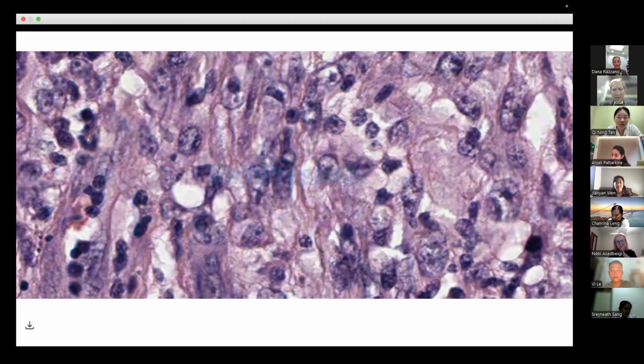We'll get into more melanocytic stuff in our next mentoring session. Today was more on the squamous lesions. And we didn't cover very many of the common things like actinic keratoses and seborrheic keratoses and so forth that you're going to see. But these were some challenging cases to think about on the margins of some of the differential diagnoses we deal with.